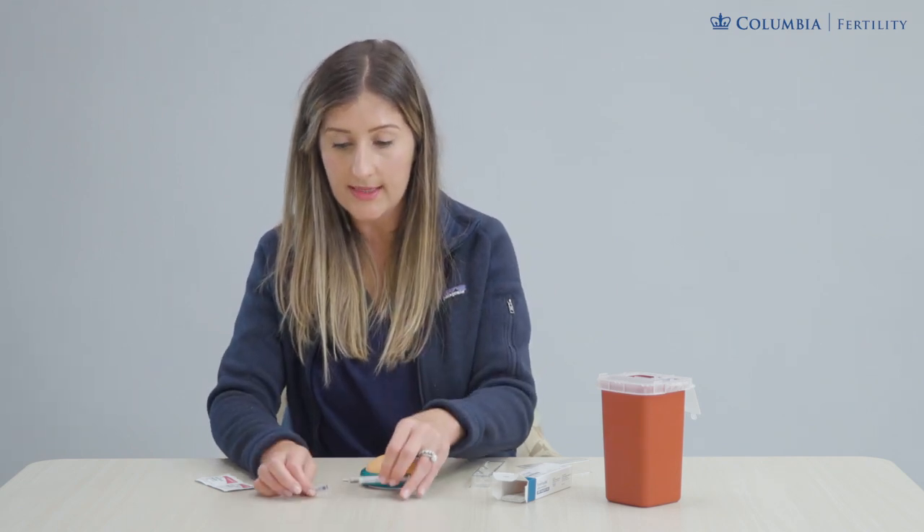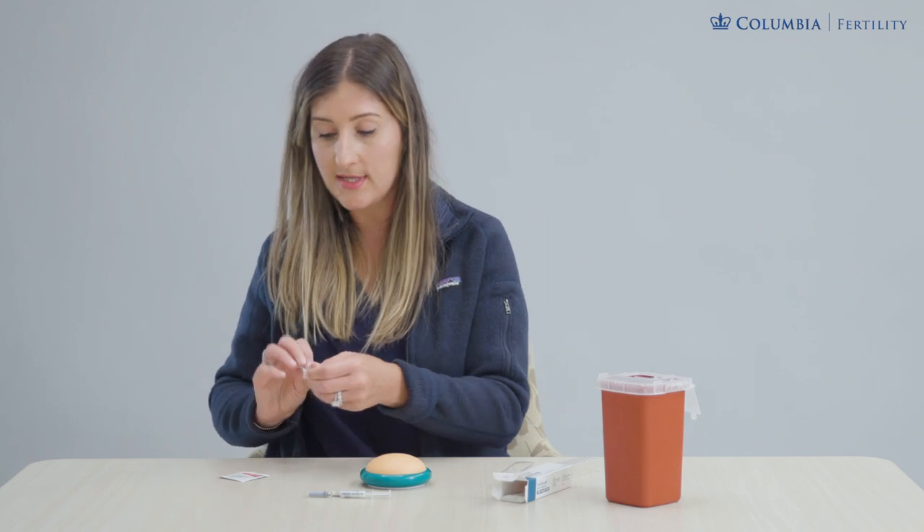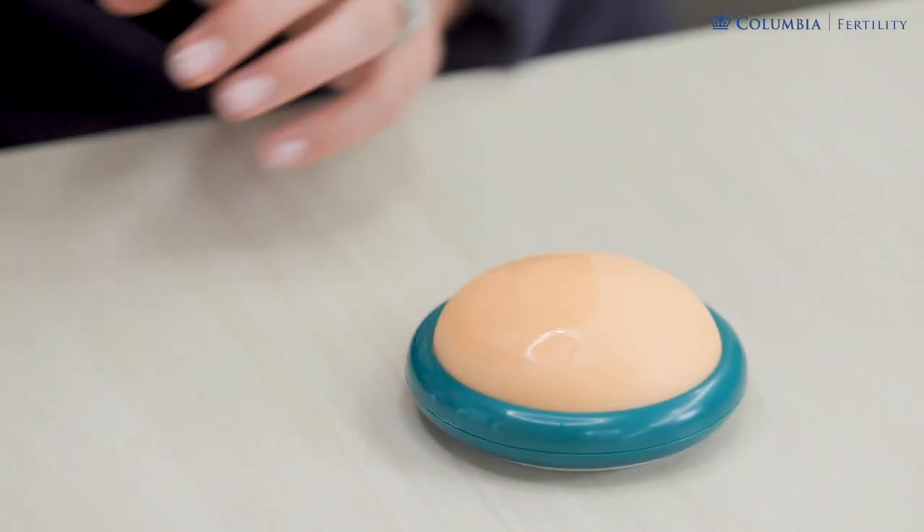So I'm going to carefully lay this aside and prep my skin. Hands are clean and washed. Our alcohol swab is going to clean that abdominal site — the u-shaped area of skin around the belly button — making sure that it's clean and dry.